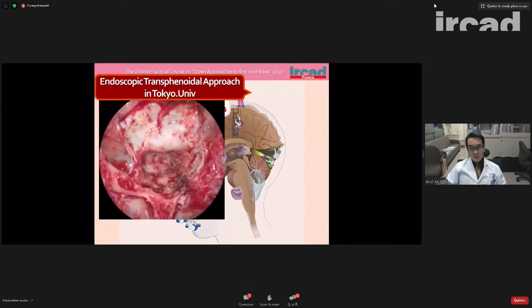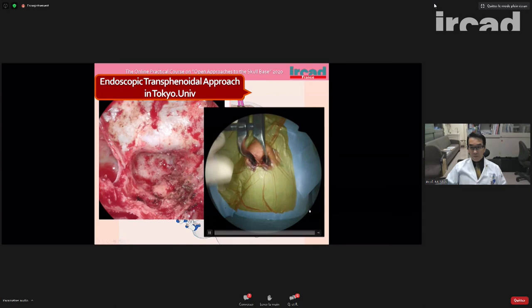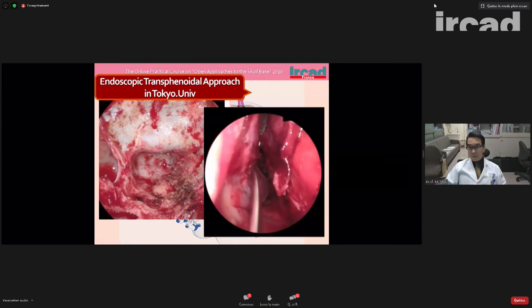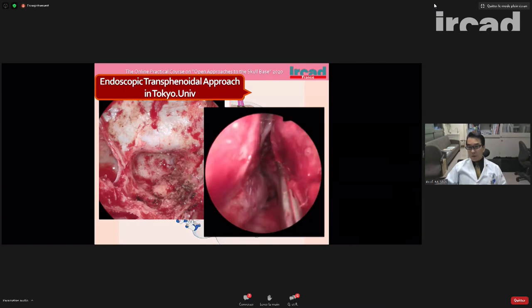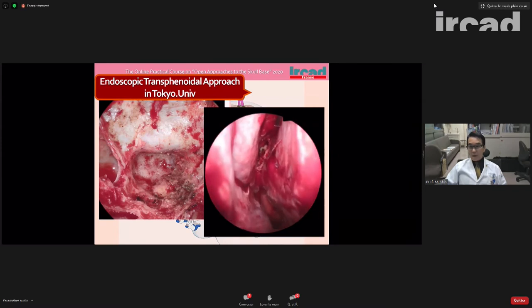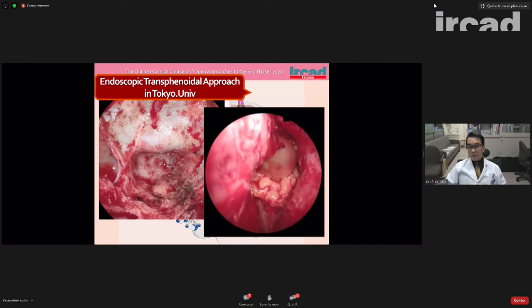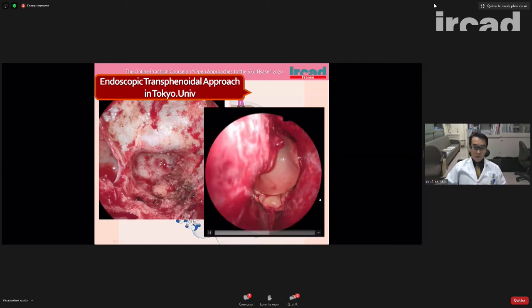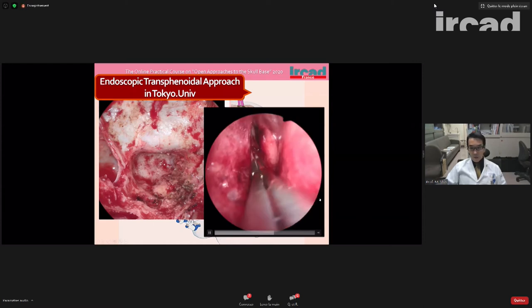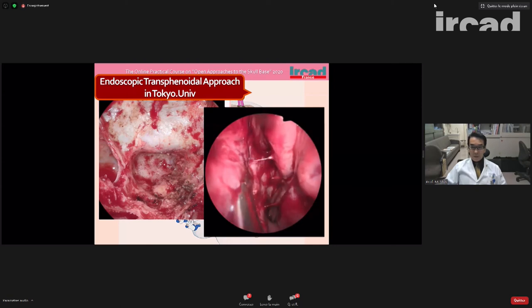Then we can perform a wide exposure of the sphenoid sinus. And after surgery, we just remove the nasal speculum and then we return the septal mucosa. This is the right nostril. And we put the balloon to compress the materials in the skull base reconstruction. And then we return the septal bone here like this.